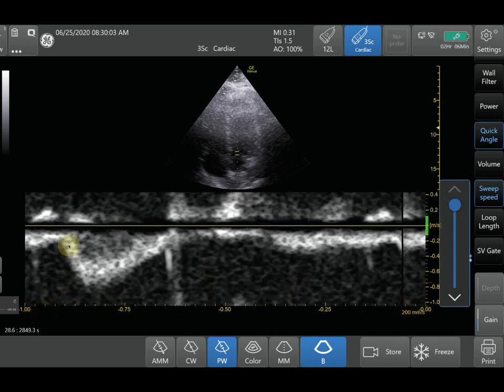The sweep speed is so high that you're literally only seeing one tracing at a time. I rarely go this high on my sweep speed because it's hard to see just one tracing and try to get a good sense of the rest of the measurements.